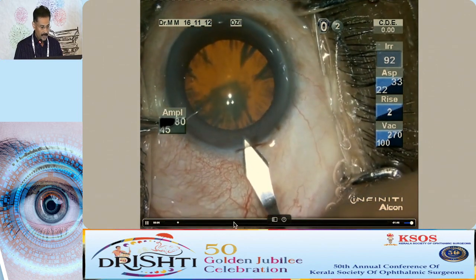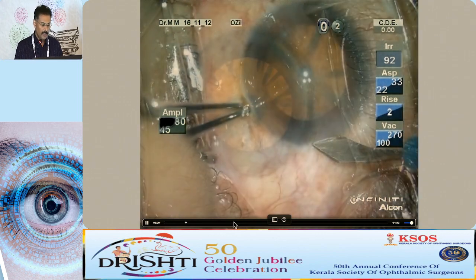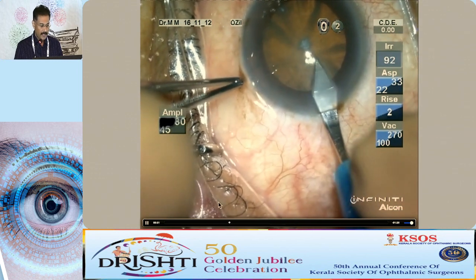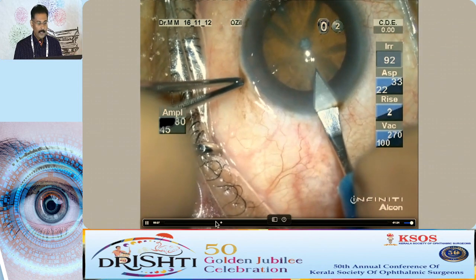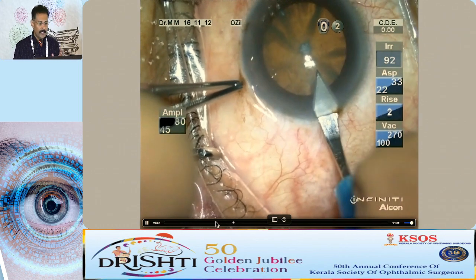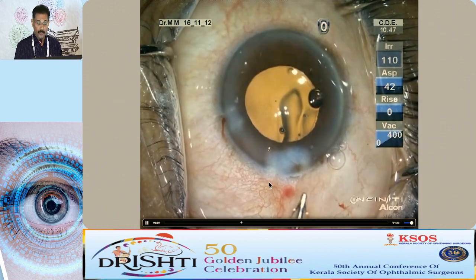So this is the 2-plane incision which I like in some cases, but mostly 1-plane incision will also do. And a single plane incision, generally once I am inside, I just cut the inner lip 0.25 millimeters, as you can see. It increases the space for maneuverability of your phacoprobe. So it makes you feel a little better. And the outer is exactly 2.4, so it doesn't leak.